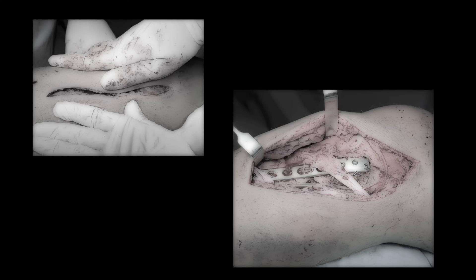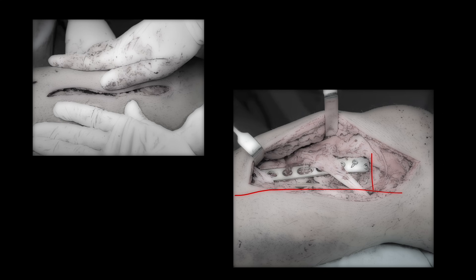There is a concern about whether you can place both an anteromedial plate and a posteromedial plate through a single posteromedial incision — and you definitely can. Simply extend your incision proximal to the joint line or slightly distally, and by retracting you will be able to expose both the anteromedial and posteromedial parts. Do not compromise healing; take a longer incision on the posteromedial side to improve exposure and avoid stressing the already compromised anteromedial skin. Here you can see the medial plate placed under the pes tendons and the posteromedial plate placed behind the posteromedial border — the wound will heal well because the incision falls over a vascular area with good muscle cover.